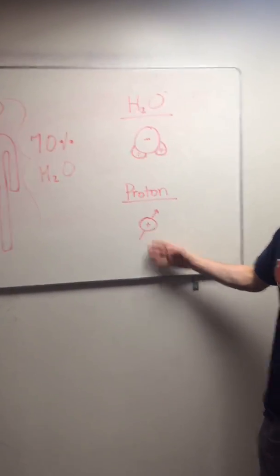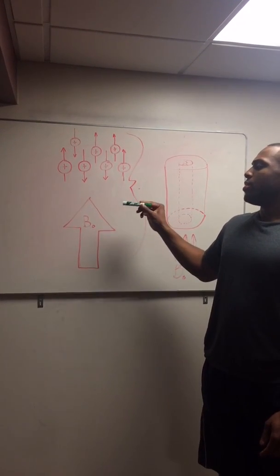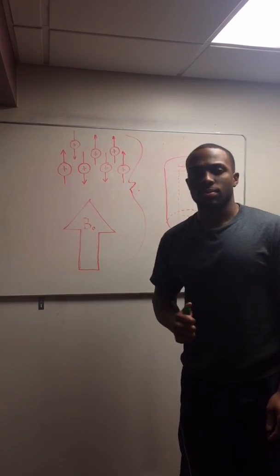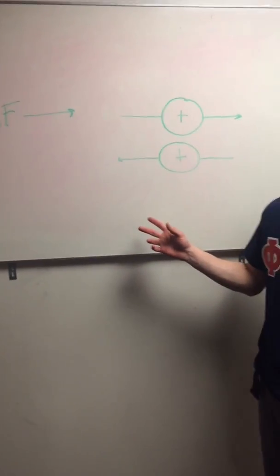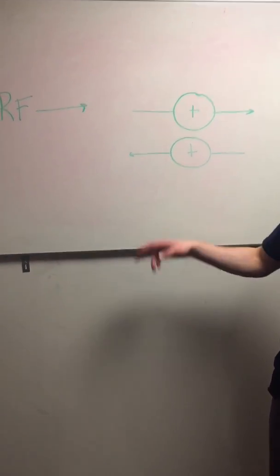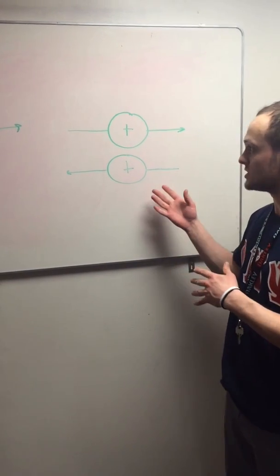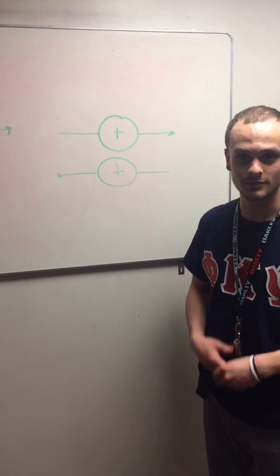When the MRI is turned on, the hydrogen atoms in our body align parallel or anti-parallel once they are introduced to the primary magnetic field, that is B sub 0. With a radio frequency pulse, we can make the magnetization of the hydrogen nuclei turn 90 degrees away from the magnetic field that was introduced in the previous segment of our video. The magnetic field will cause these atoms to precess, and the machine will pick up this signal.